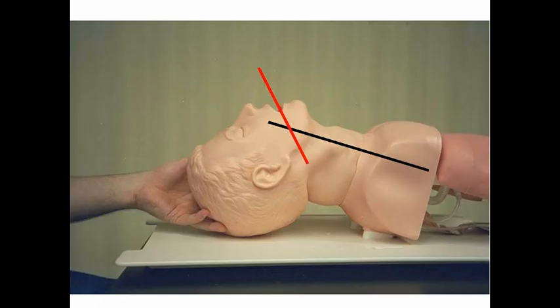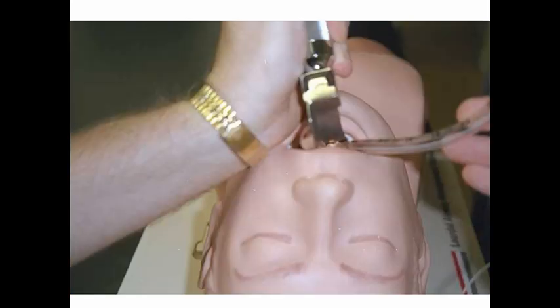At this point, the oral axis, shown in red, and the tracheal axis, shown in black, will be almost collinear, a straight line. So you should have a very reasonable view of the larynx and a straight path to the larynx. Now, to intubate it is often a simple matter of advancing the endotracheal tube along a straight line down the airway, through the glottic opening, past the vocal cords, and into the trachea.